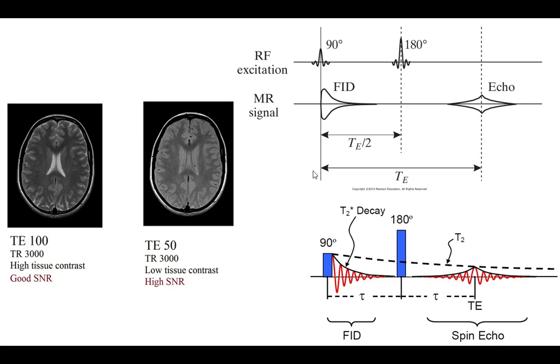So the signal to noise ratio gets worse when you wait, because the signal is dropping, but your tissue contrast increases because everybody else dropped faster than you. Wait longer, and you have no competition for the readout, but your signal is so low it's hard to read. Do it early, and there's lots of competition, so it looks blurred, but your signal is strong.